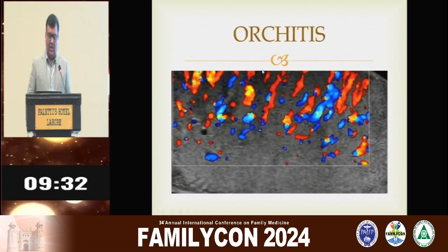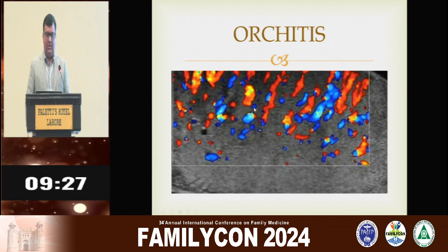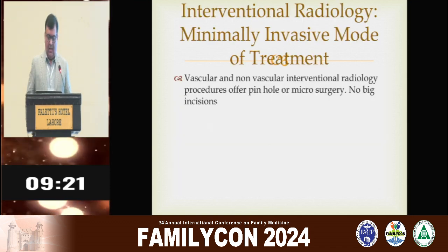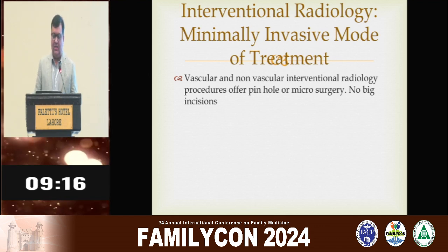And this is how orchitis presents. So here the flow is more. When you are evaluating scrotal pain, keep these things in your mind. The next part is interventional radiology.